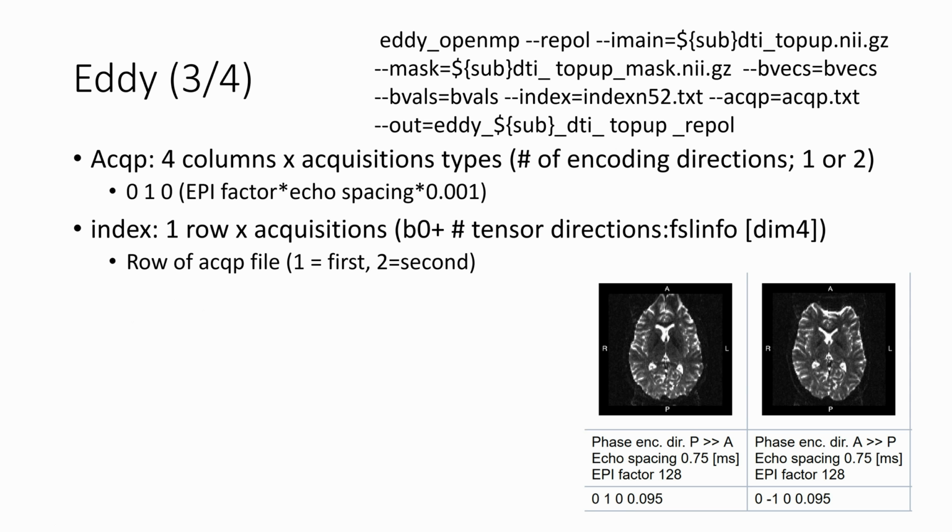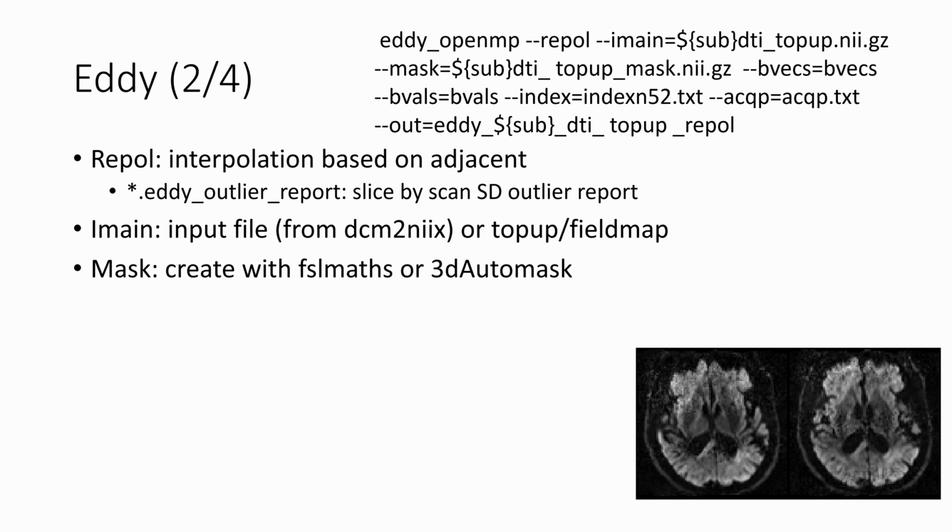When it comes to things like the diffusion, you're more able to just go, okay, if I scan your diffusion for 3 minutes in one direction, and I scan it in the other direction for 3 minutes, I can average. I can take those two, and probably not too much white fiber has moved in that time. You need to control for sort of the head shifts, but the actual underlying data should not have changed too much in those 3 minutes. If it has, you've got bigger problems. Your subject's brain is exploding or something like that. So pay attention to that instead.